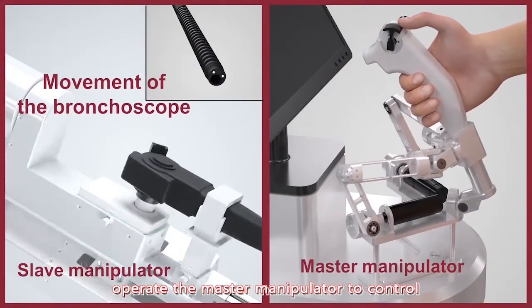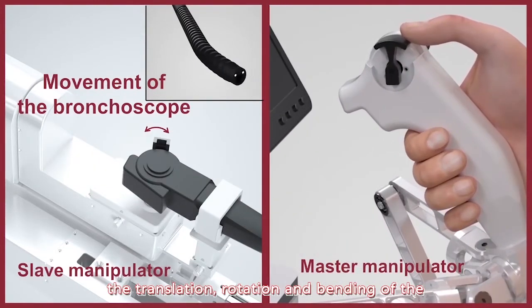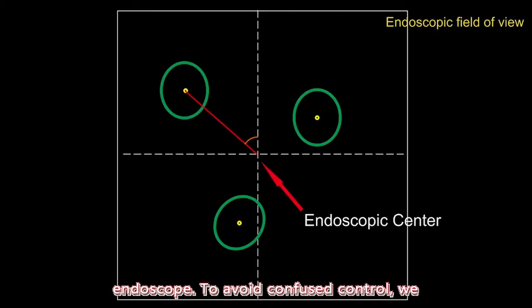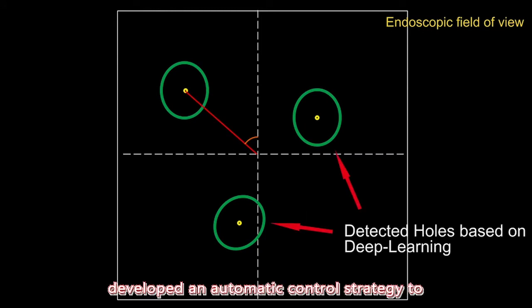Doctors can operate the master manipulator to control the translation, rotation, and bending of the endoscope. To avoid confused control, we developed an automatic control strategy to ease the operation.